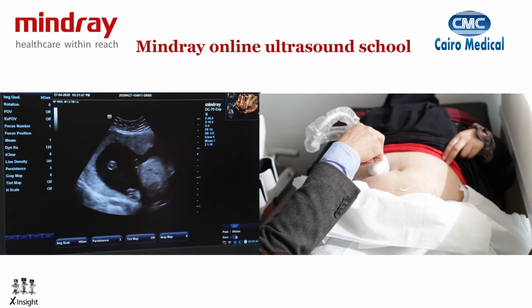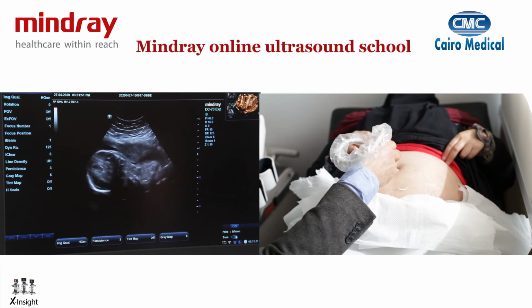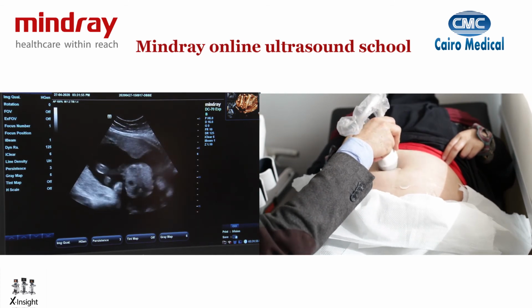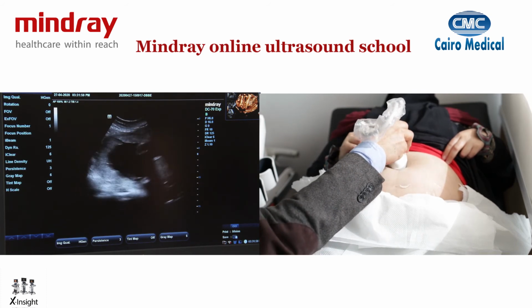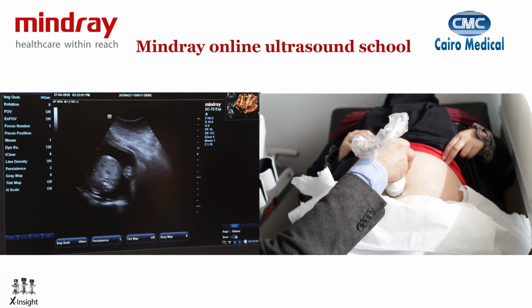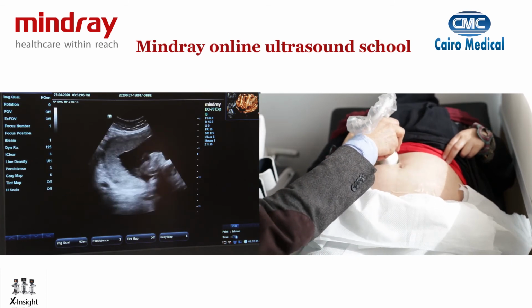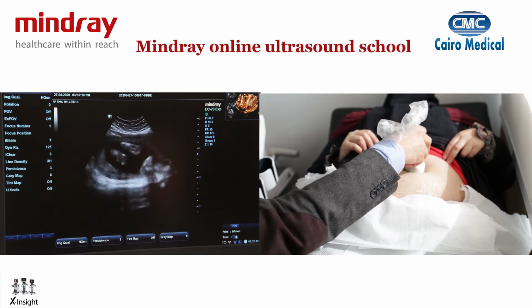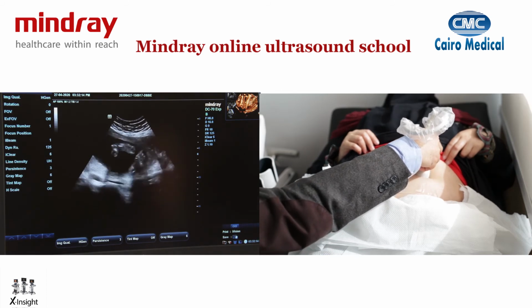Let's do a bit more. Let's get actually the spine. So we've seen face, we've seen gender, we've seen limbs. Let's try and get the hands. The hands are usually on the side of the body. So if you get a view of how the baby is lying, I move the probe, as I mentioned, at an angle always touching the mother's skin at 90 degrees, and I slide it from the top downwards, and I move to the side of the baby where I could see the hands. You can see the hand here on the side.